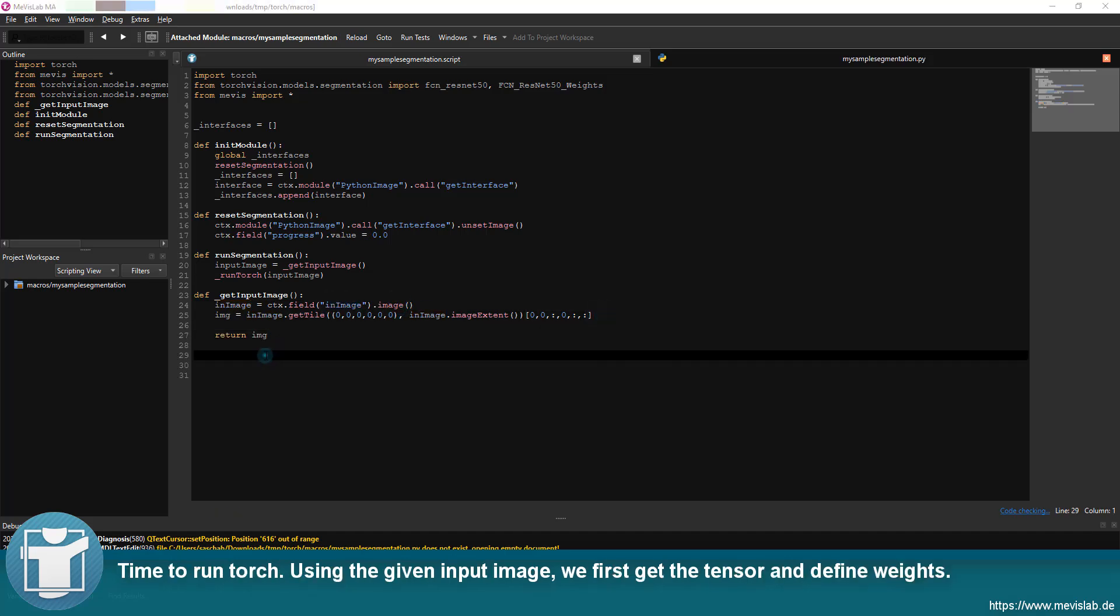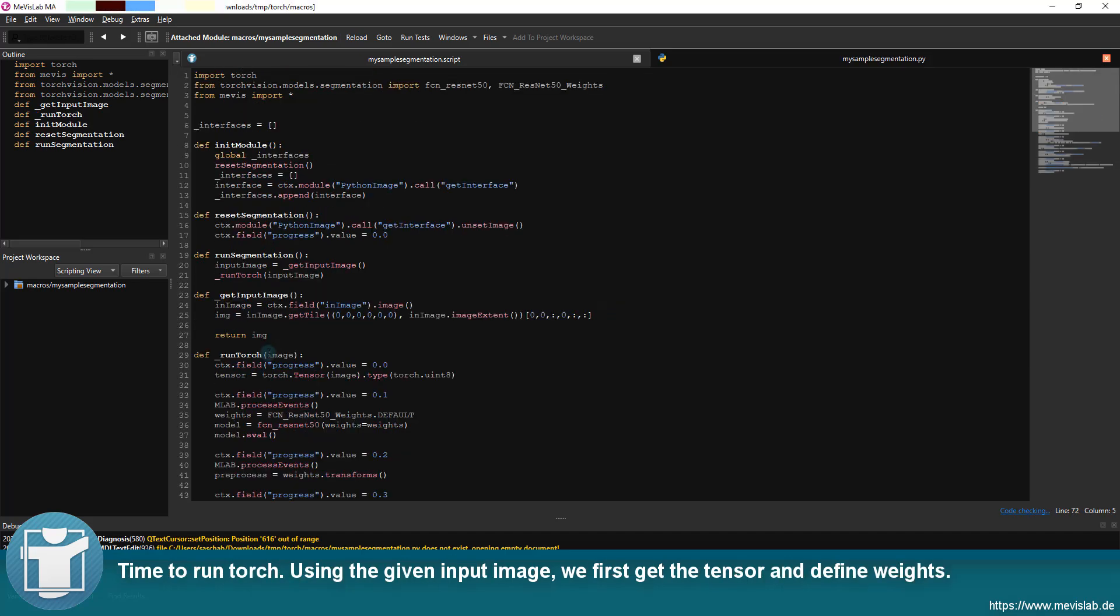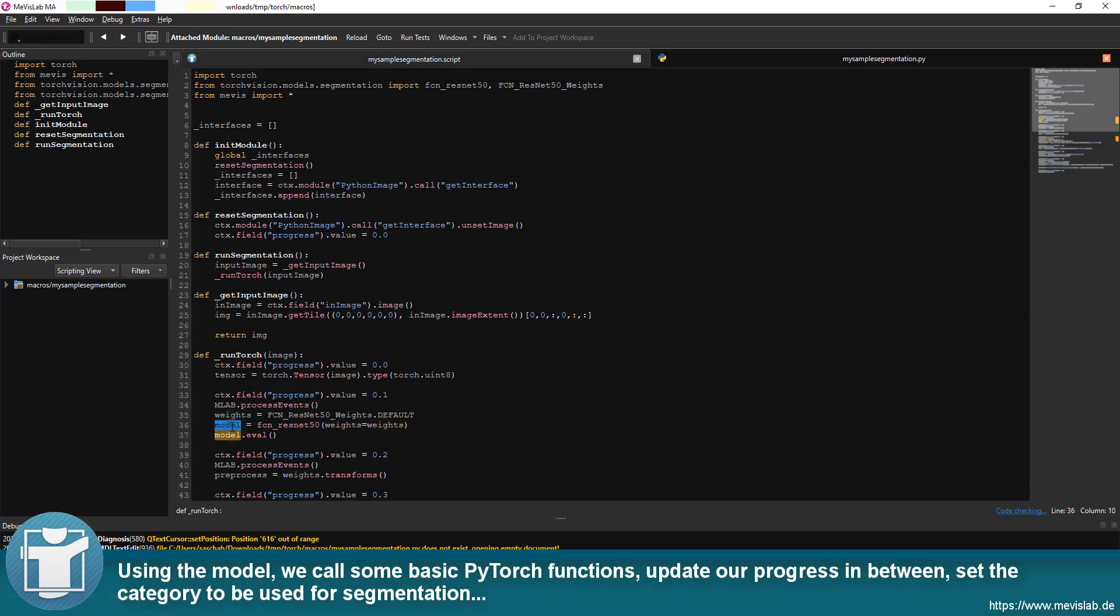Time to run Torch. Using the given input image, we first get the tensor and define weights. Using the model, we call some basic PyTorch functions.